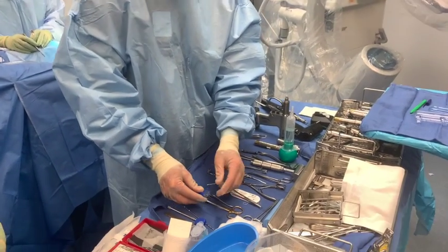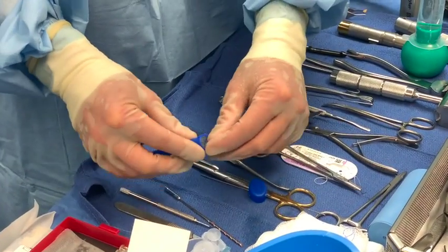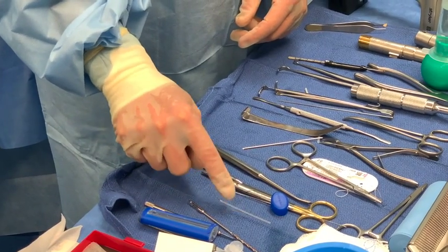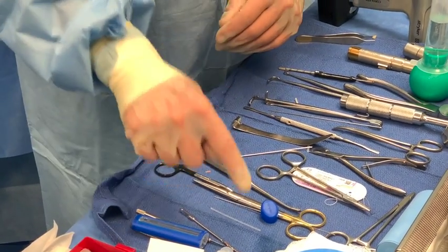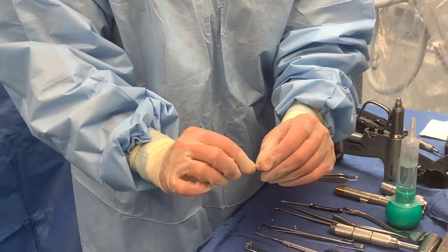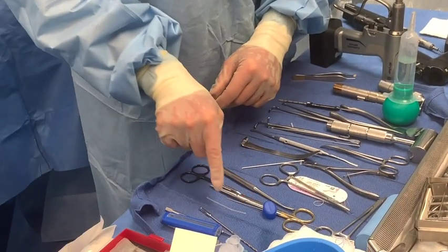If you zoom in right here, it comes in a convenient packaging to protect it. The cap comes off, give it a tap, and it comes with a 70 millimeter pin that you can use for one toe or even two at some point in time. It's easy to cut, it's flexible, and the key is — you'll see this with the toes — you can actually bend this material and actually get a bend out of the toe.